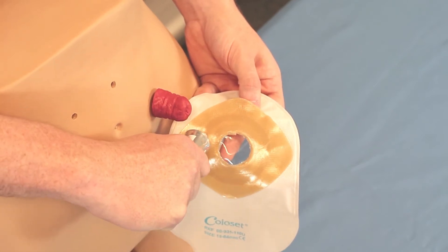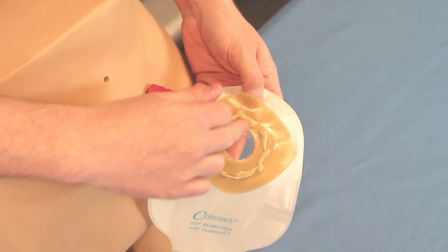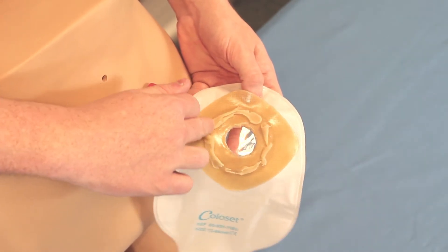So what we are going to do is to add a thin bead of stoma paste. Take the bead and even it out so that it is not too thin and not too thick, all the way around the opening.